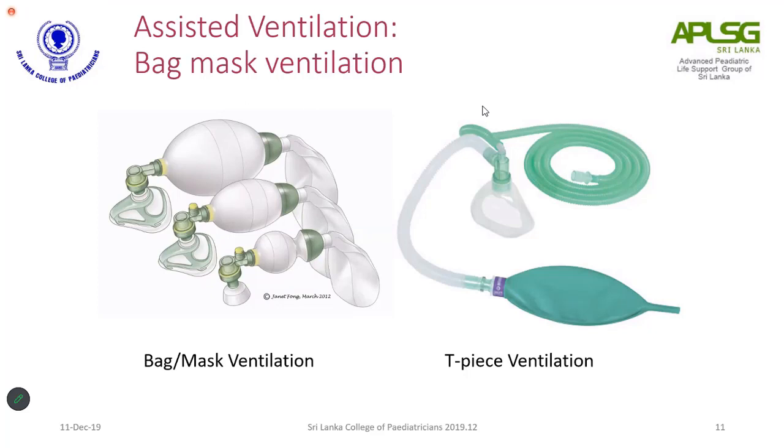and for an older child it's about 400 ml. T-piece ventilation is not commonly used during resuscitation but is commonly used by the anesthetist for various procedures done in children, to provide some ventilatory breaths for a short duration.